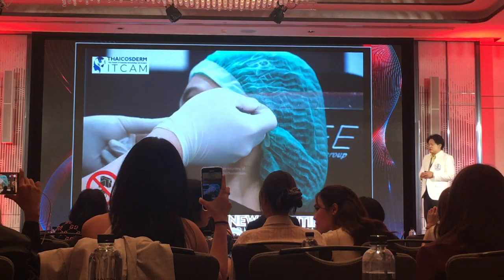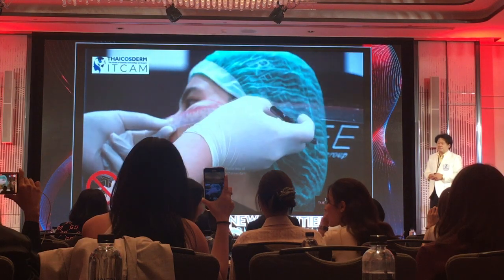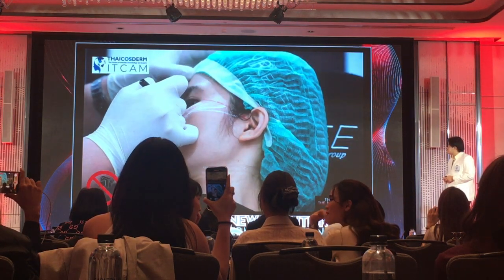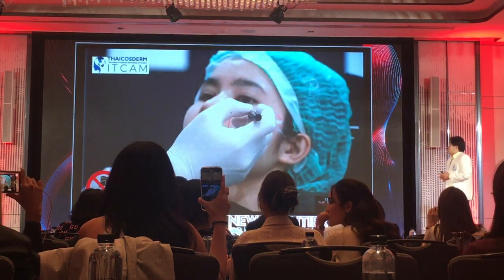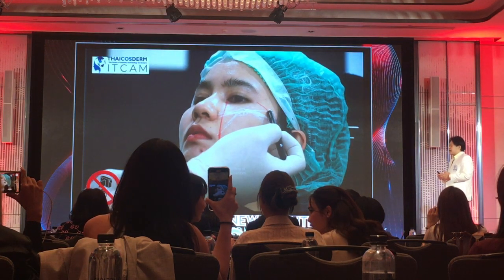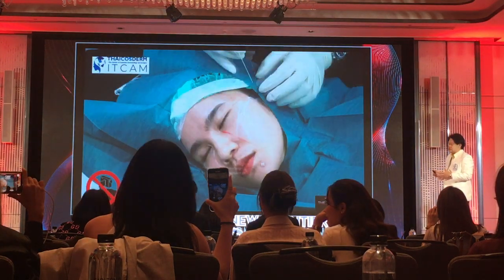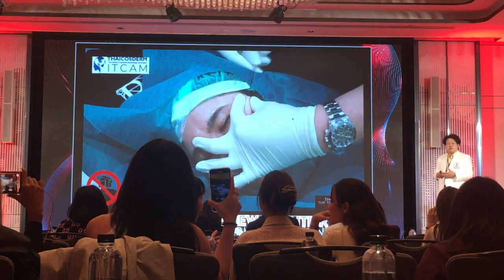So actually you can use any kind of bidirectional convergent thread. And in this case, I use the free floating. The difficult thing for this free floating is how can you bend down the needle, or how can you curve the needle, and stay in the superficial layer, because many times many people do this technique and they go too deep into the deep layer.